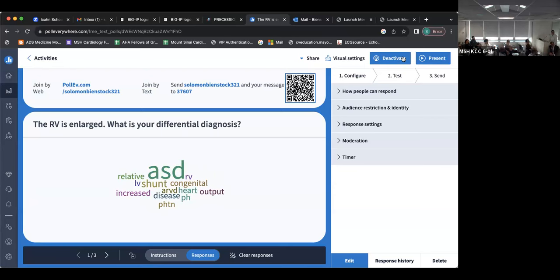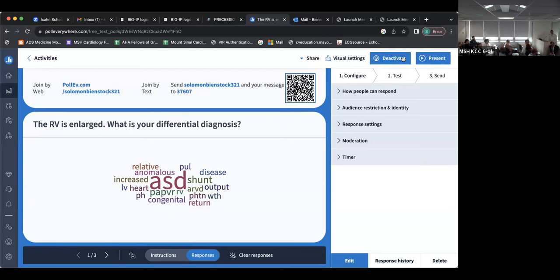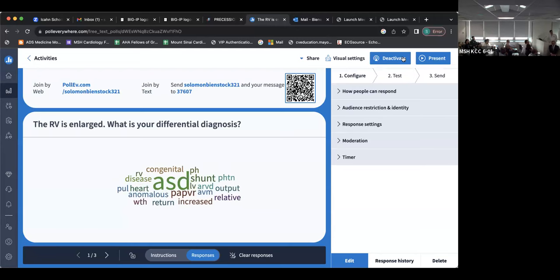I can hear. So when you look at right-sided enlargement, as was mentioned, it looks like it may be a volumetric phenomenon. More for the fellows, you always have to think in your mind, if this is a volumetric phenomenon to the right side and the heart's enlarged, then where is the volume coming from? If that volume is coming into the right side of the heart, then you need to go looking for some sort of mechanism that is causing that volume to come into the right side of the heart. So even though you can say right atrial, right ventricular enlargement, we really haven't thus far figured out where the volume's coming from.